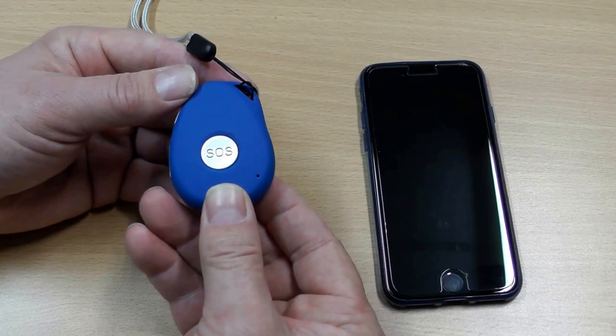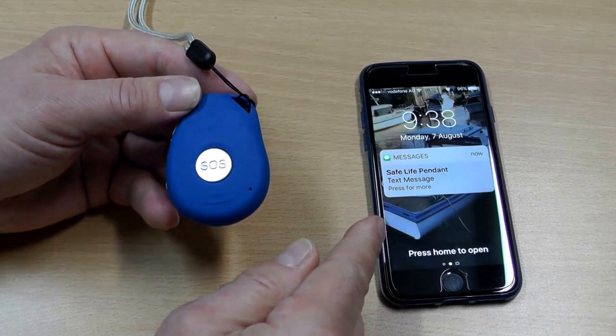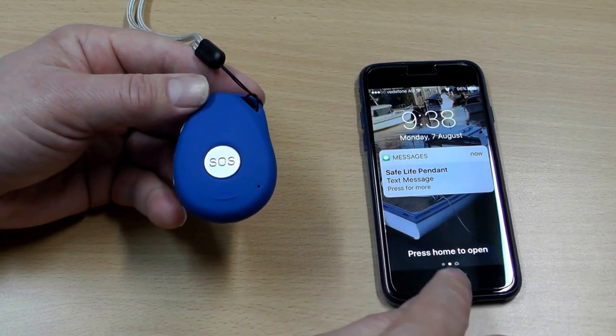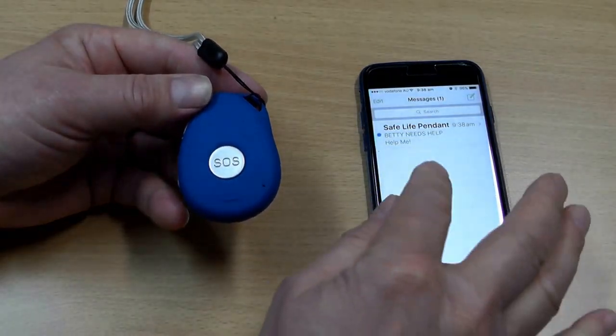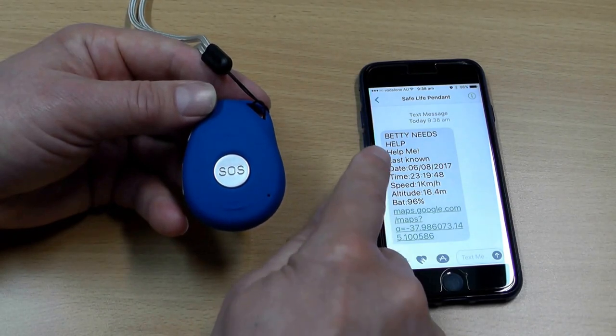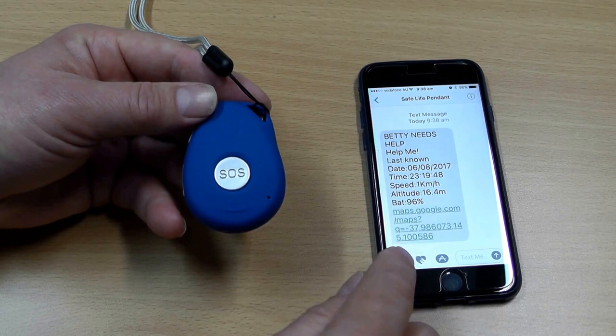It's now sent a text message out to up to five different mobile numbers. In a moment it will come onto the mobile phone here — it says SafeLife Pendant, that's what I've called it in this instance. There it says SafeLife Pendant, help me, and you can see I have here the ID message 'Betty needs help'. The battery life is 96%.